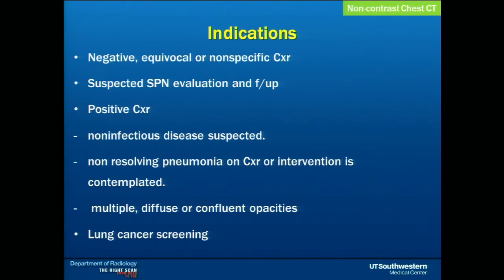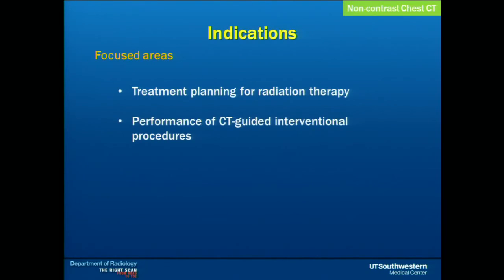In addition, lung cancer screening is going to be coming a big way as an indication for non-contrast chest CT, and Dr. Brewington will be talking about this later in the day. Other indications also include treatment planning for radiation therapy and performance of CT-guided interventional procedures.